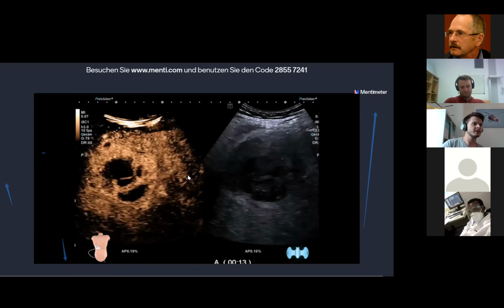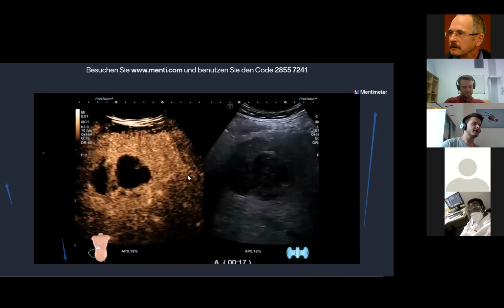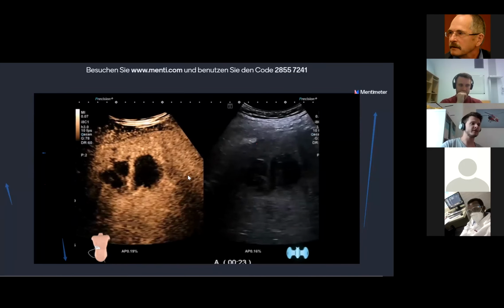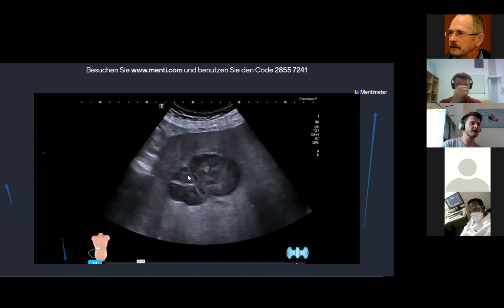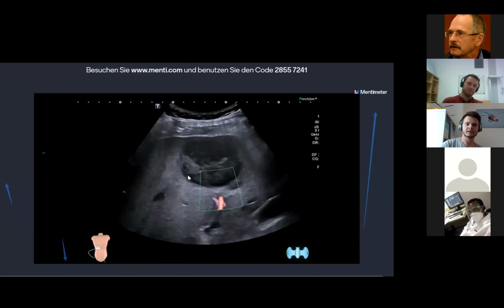And I think here it's also a very good loop to show how you can differentiate between malignancies or after trauma, and it's also very fast, and you can also combine it with a eFAST in the ambulance. Okay, perfect.